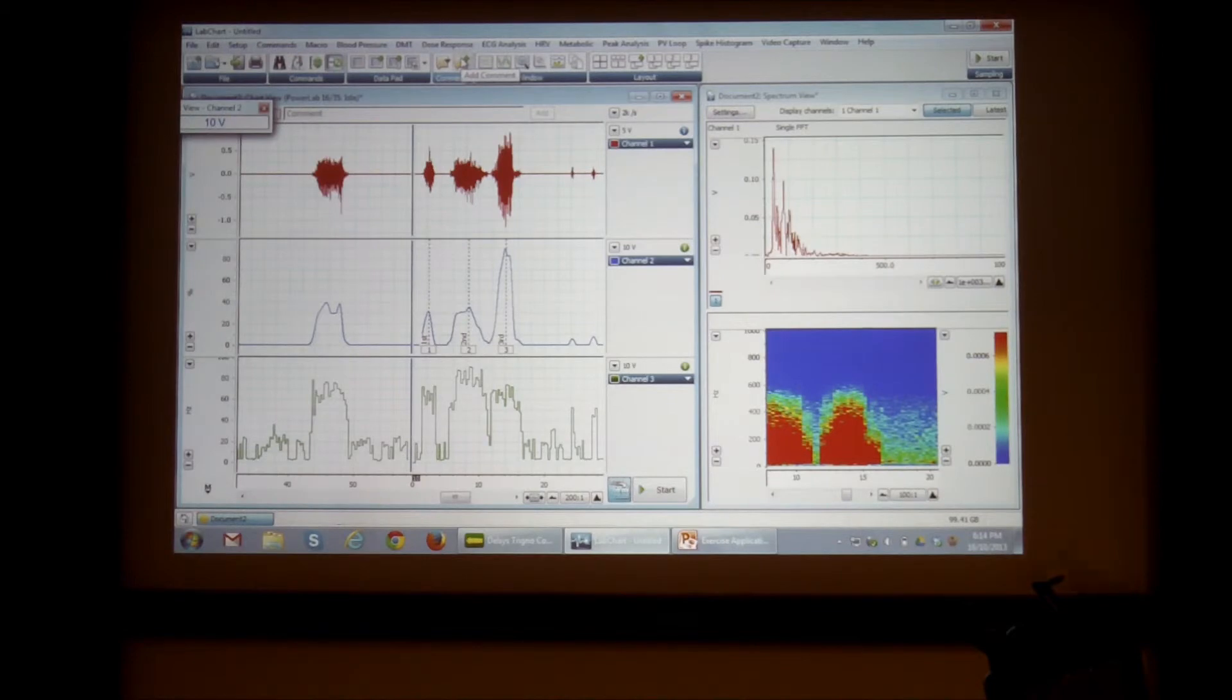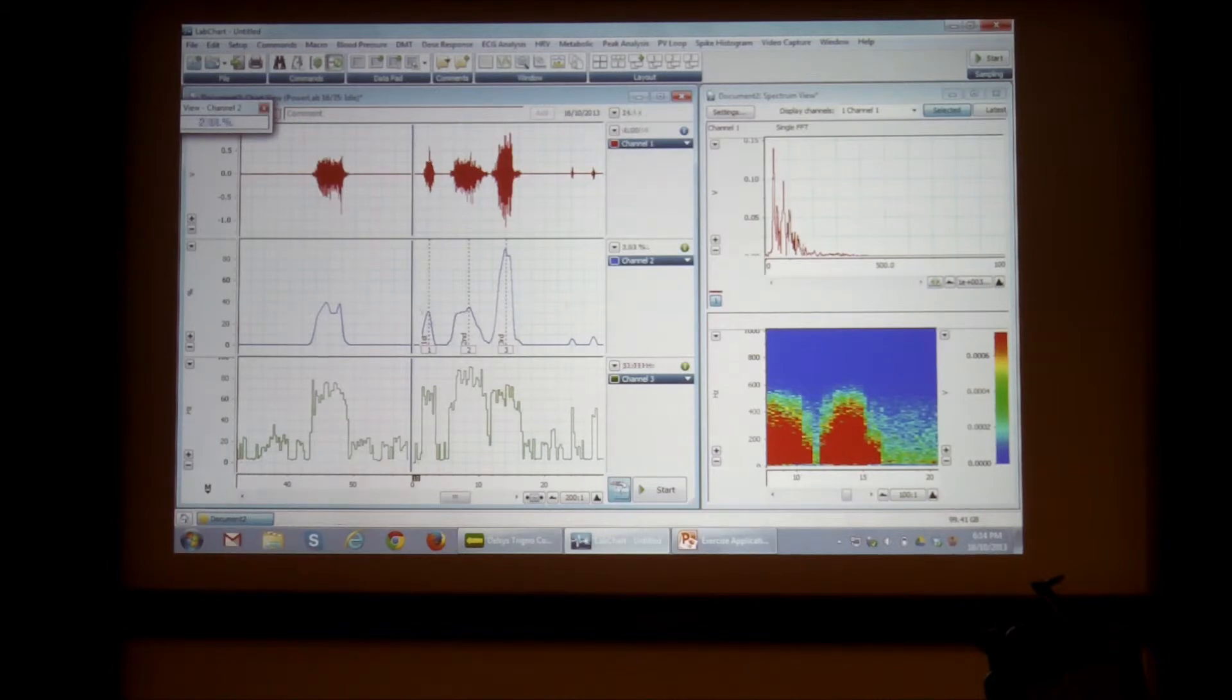So first, second, third contraction. Then what I'm going to do is I'm going to add this information to our data pad.